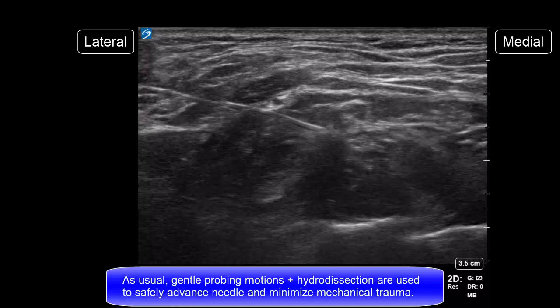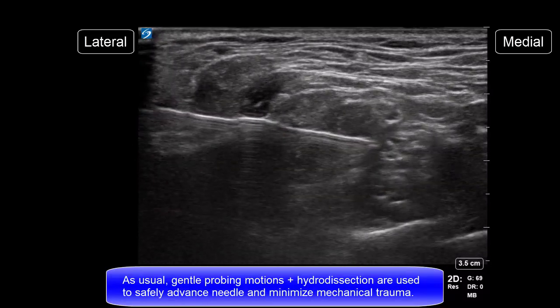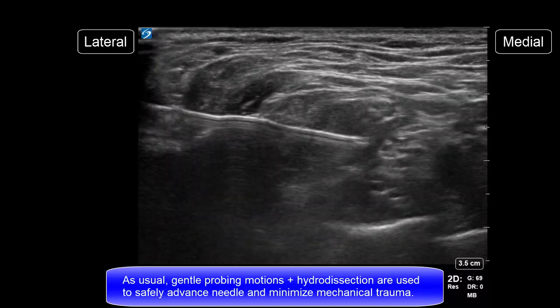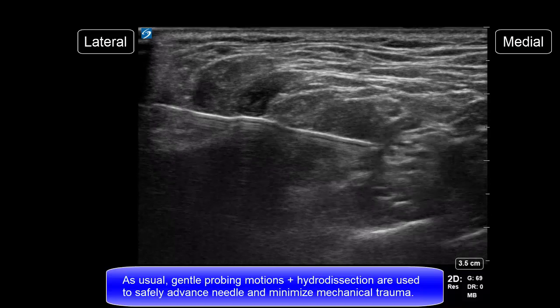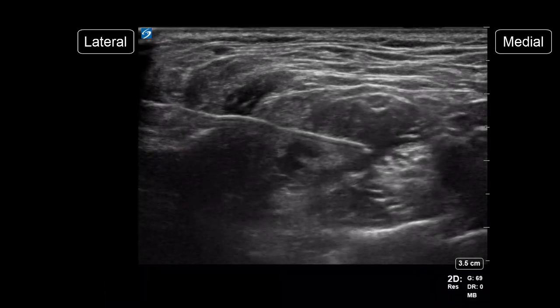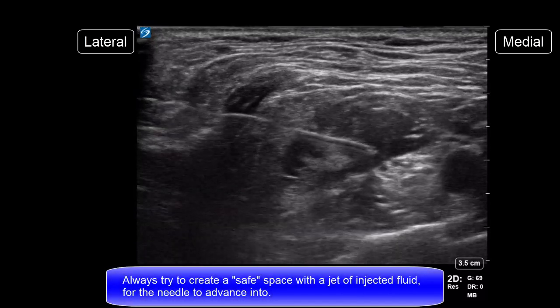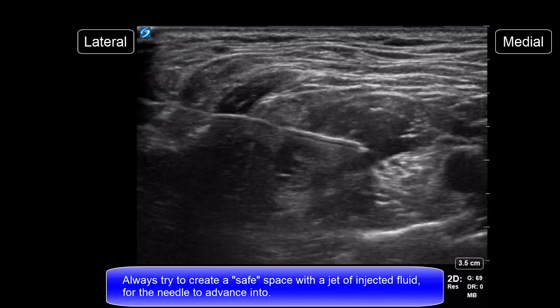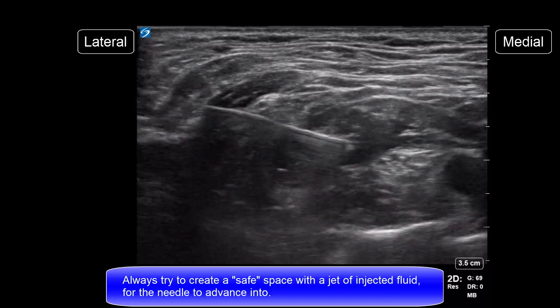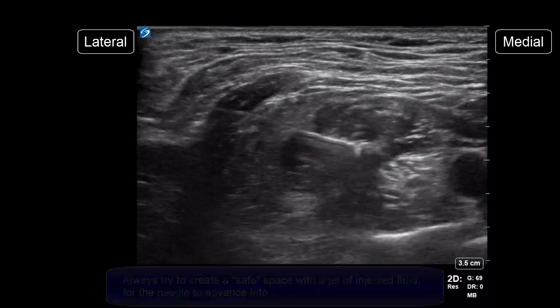Once again, use gentle probing motions and hydrodissection to safely advance the needle between the trunks and minimize any risk of mechanical trauma. Take advantage of the injected fluid jet to create a path for the needle. If adequate spread is obtained with the fluid jet alone, there may be no need to actually advance the needle any further.